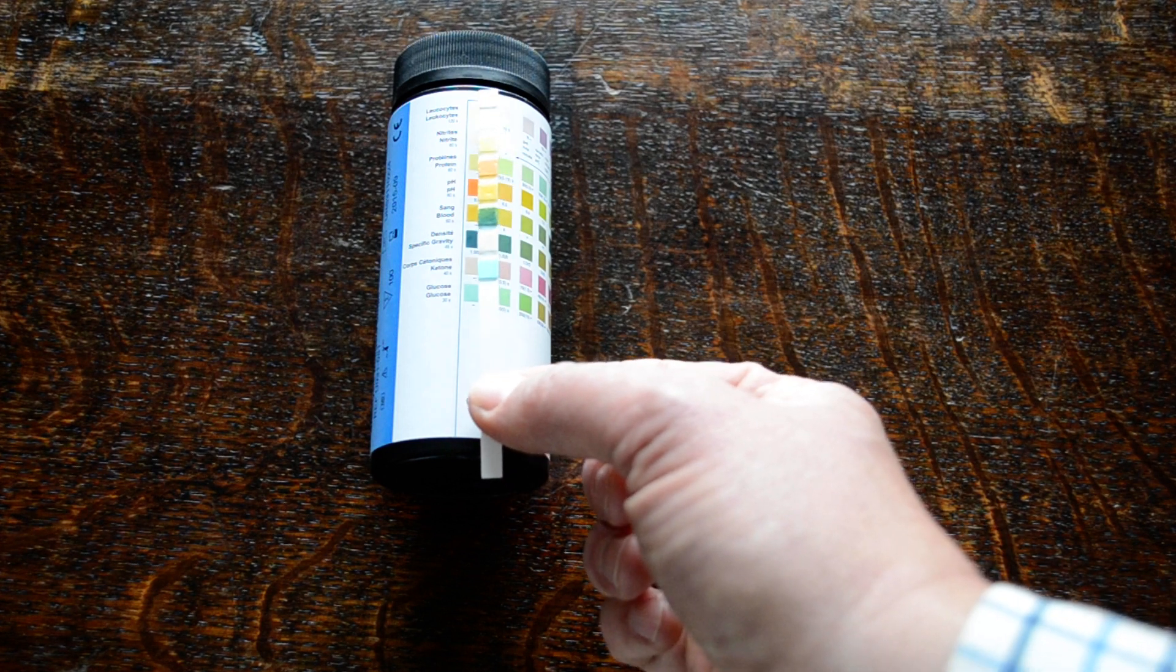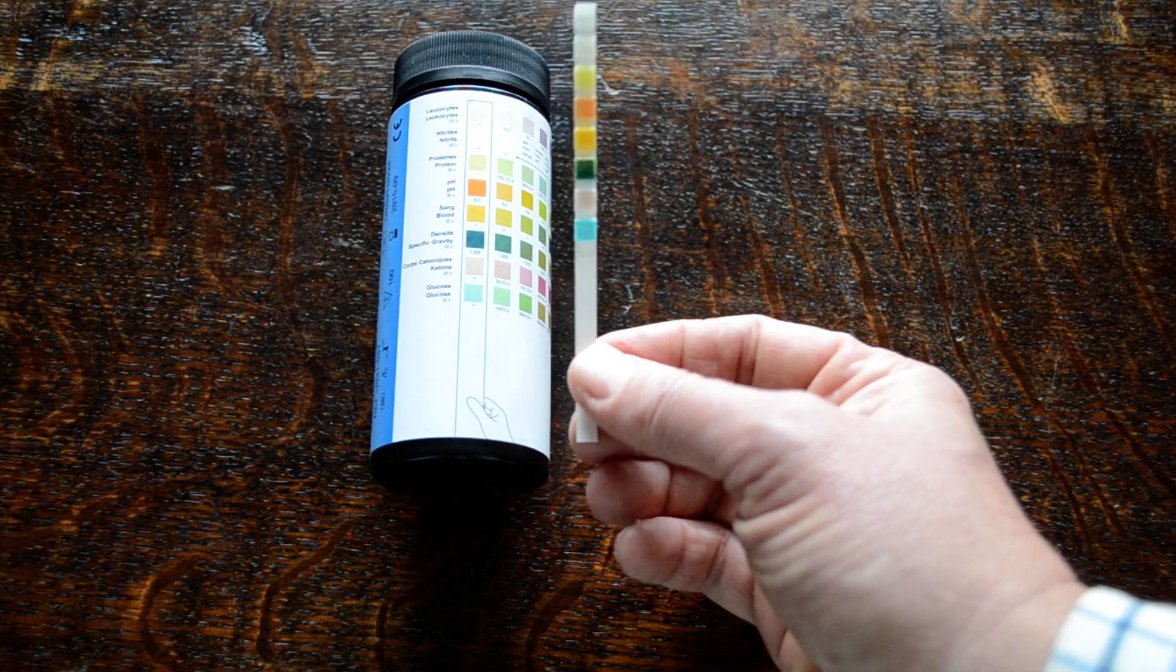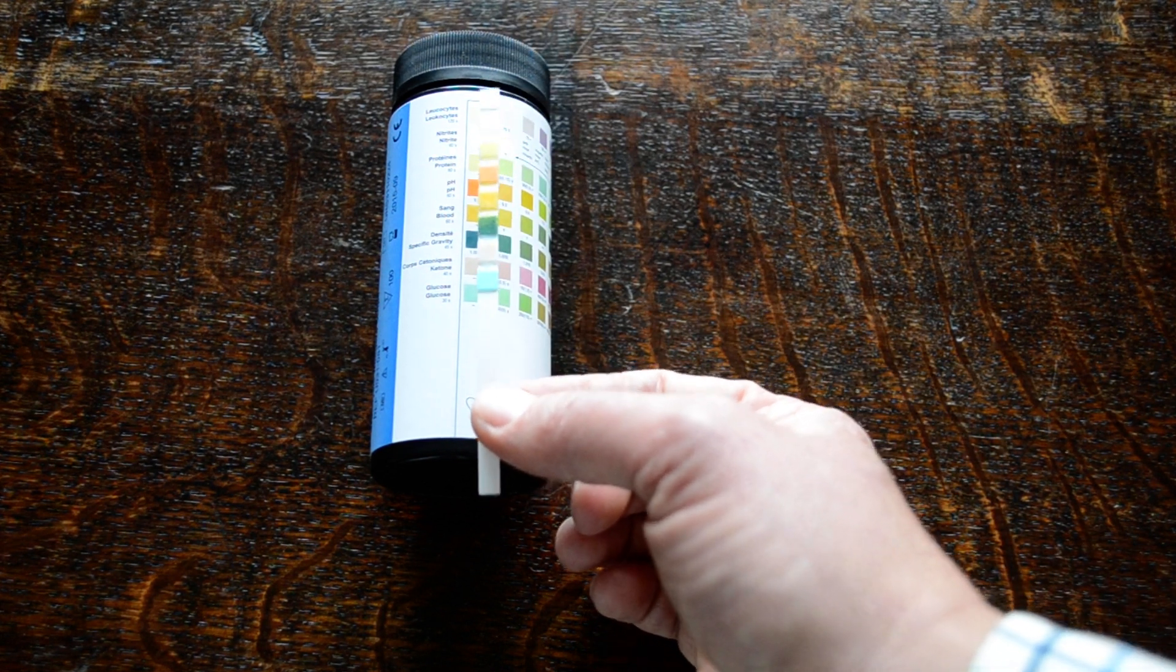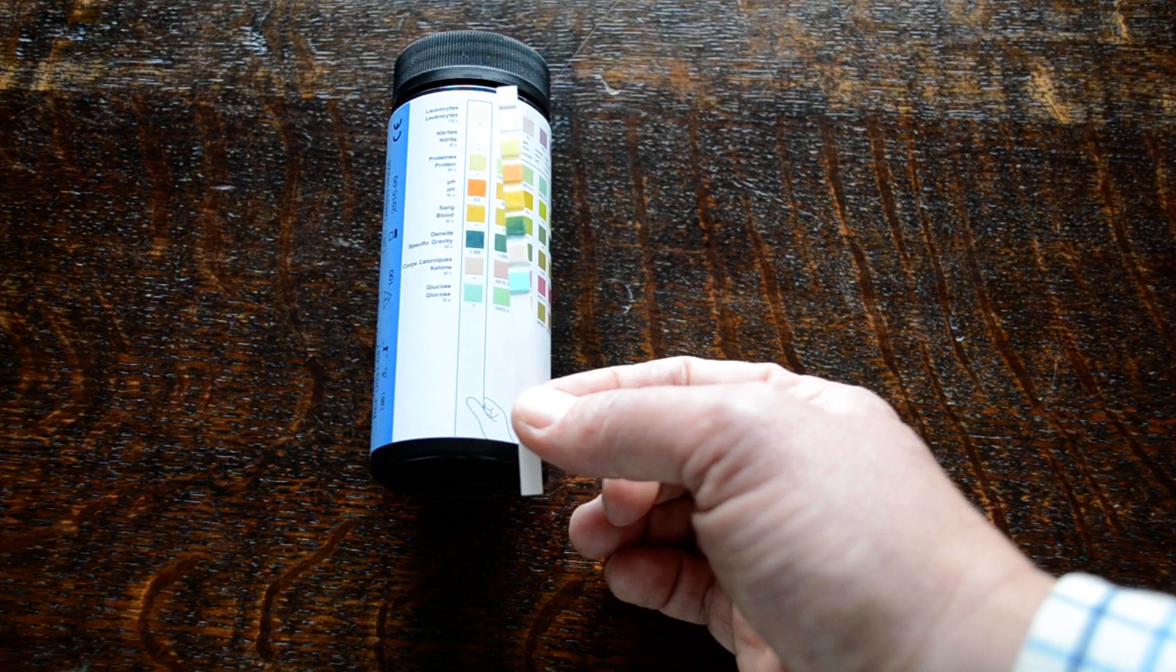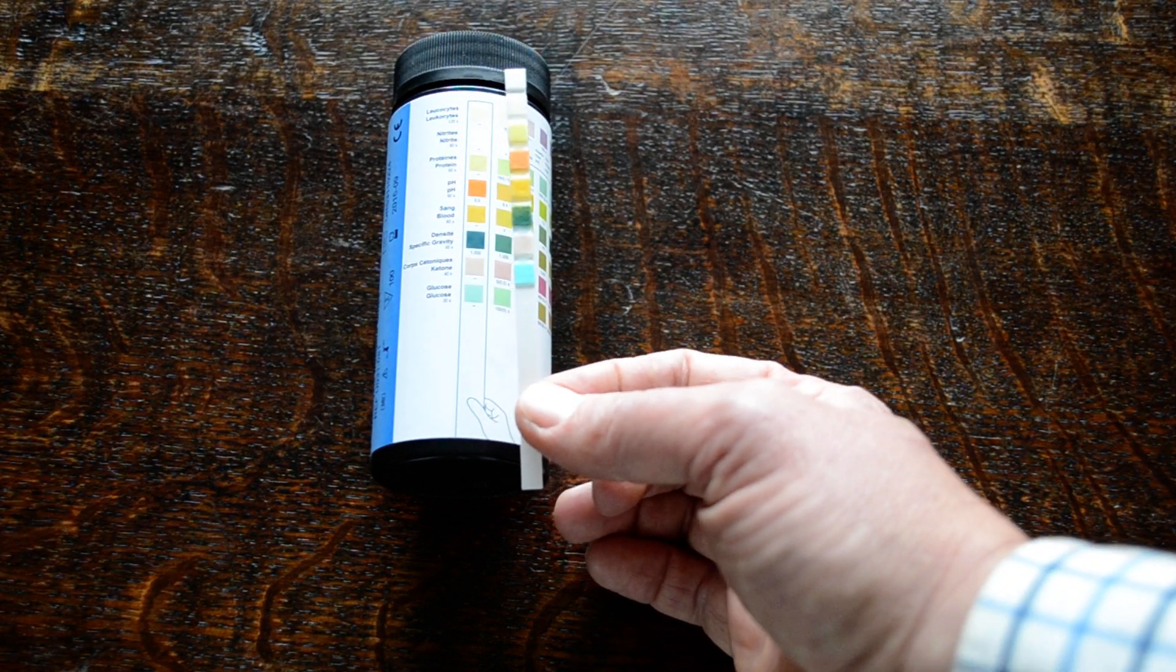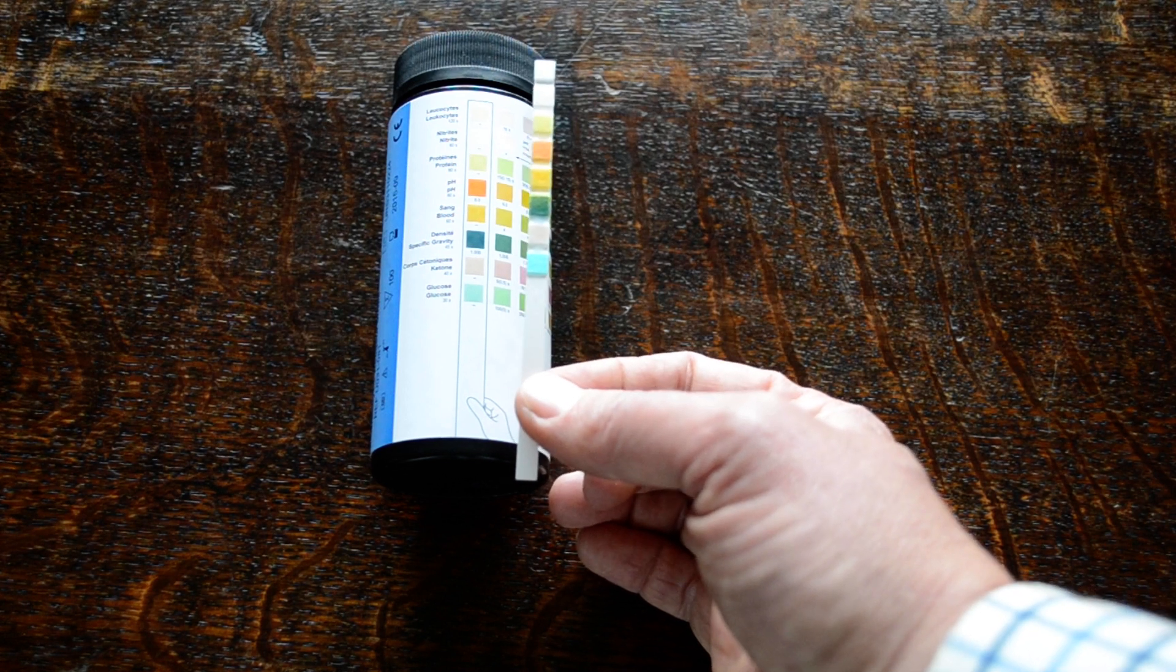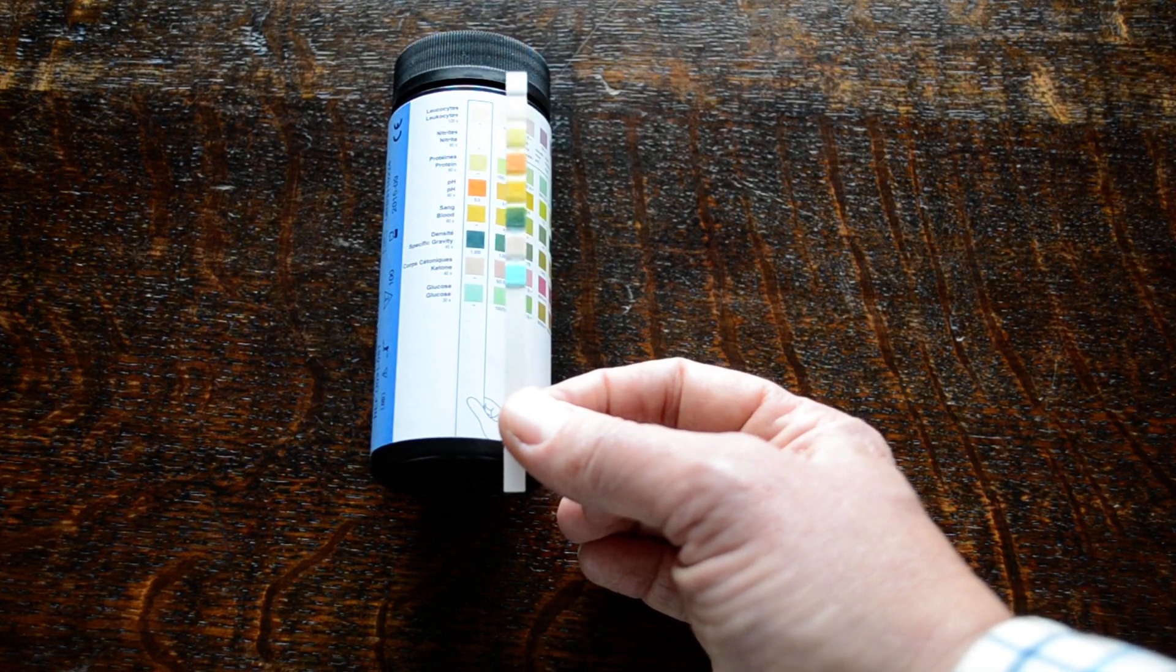And then we're waiting for a further 60 seconds for the development of any leukocytes. But you would start to see some color change at this stage if that was the case, and I wouldn't expect these pads to pick anything up on this urine sample that we've dipped. So that is an all-negative result for this sample.